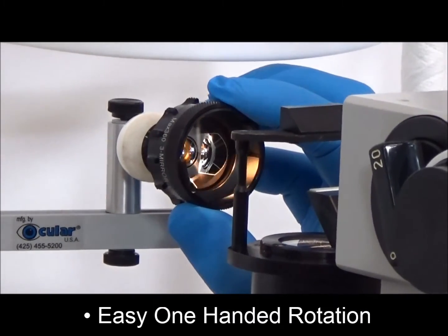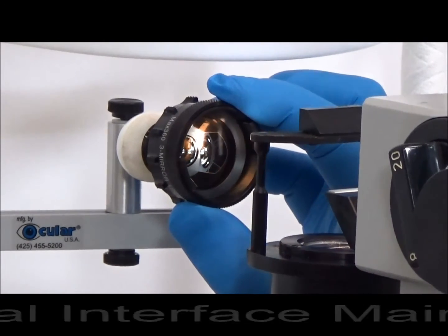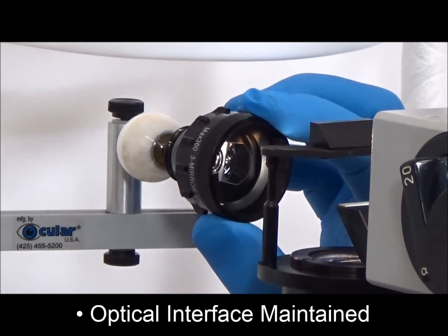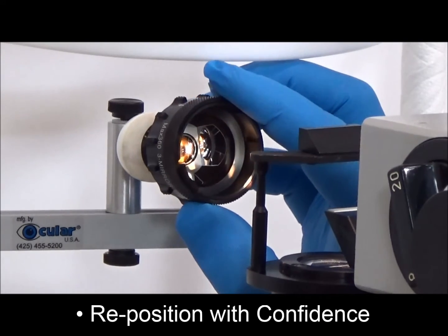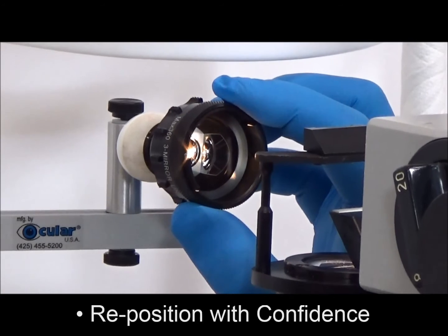Notice the lens does not require a second hand for repositioning during rotation. This greatly reduces the chance of the lens decoupling from the patient's eye. Should the lens decouple, repositioning is easy with the built-in indexing feature. You can be confident that you will maintain the same viewing location as prior to repositioning the lens.